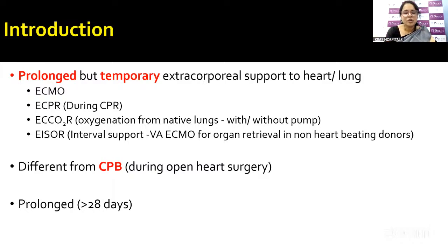Now, although this is also temporary extracorporeal support, cardiopulmonary bypass is typically a very short duration transitional support, which generally is for say 4 hours or 6 hours, where the patient is on an induced circulatory arrest, and extracorporeal support is given for the circulation, the heart as well as the lungs. Whereas ECMO, as we understand, is prolonged or longer duration and temporary extracorporeal support.